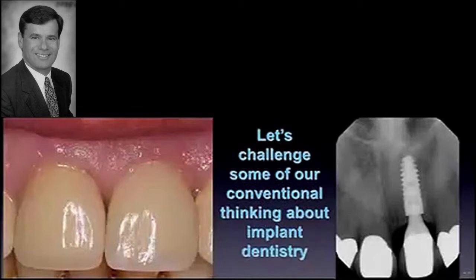We're going to talk about placing an implant, and I apologize, it looks like the projector is just not great. You're not seeing this, but this implant is significantly subcrestal. And the conventional wisdom, for years and years, says you can't place an implant subcrestally and get away with it. I want to challenge you today to think that that's not true. I do apologize, it's just not very clear, but there's nothing we can do at this point.